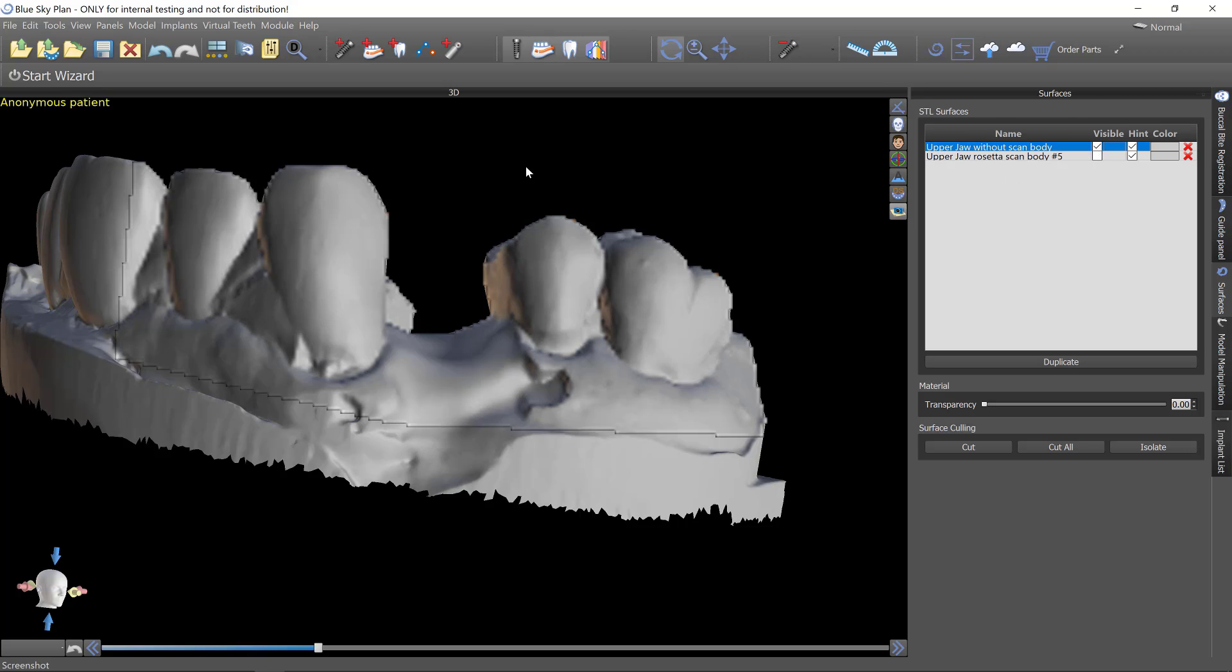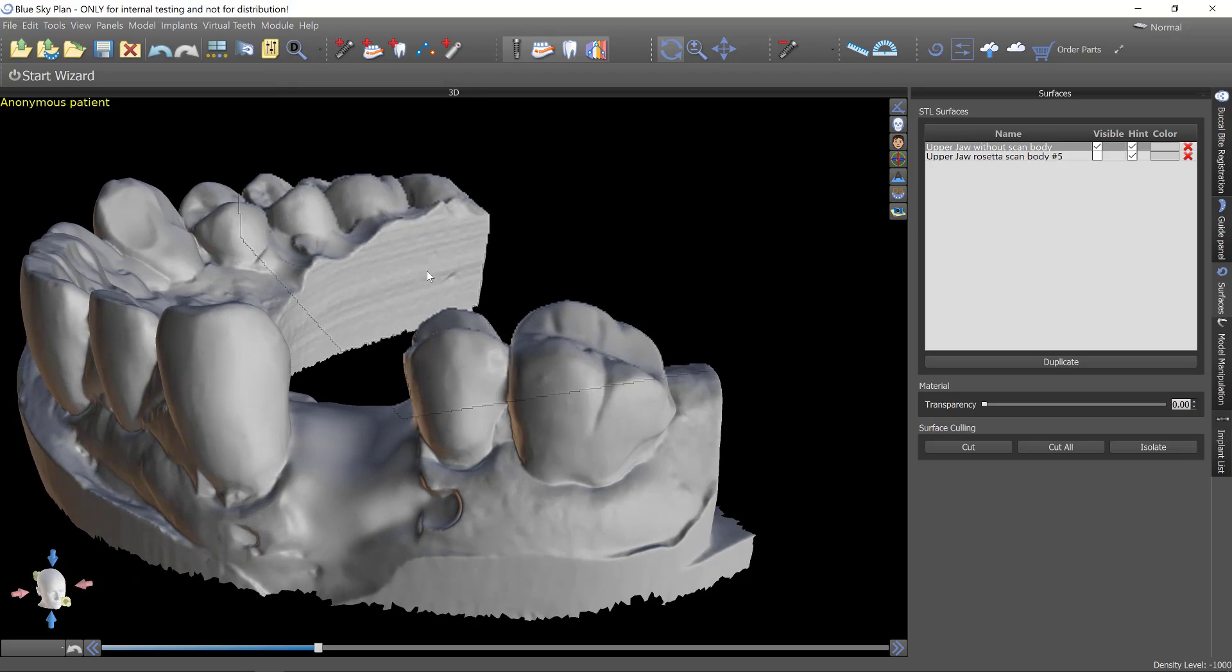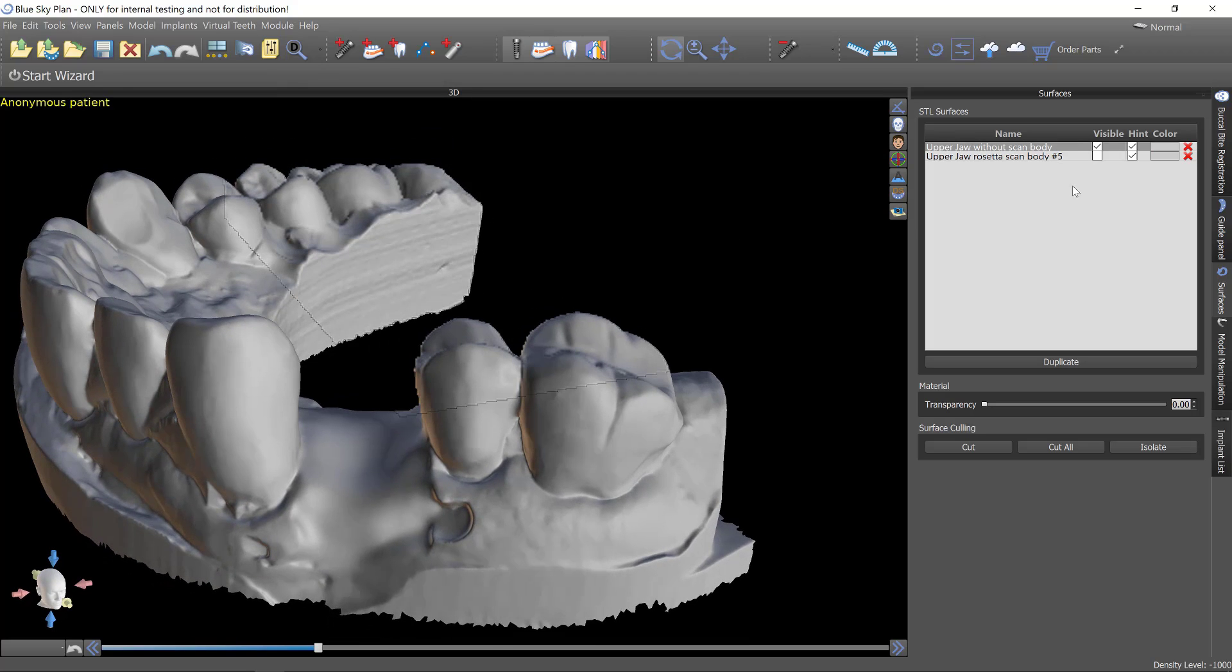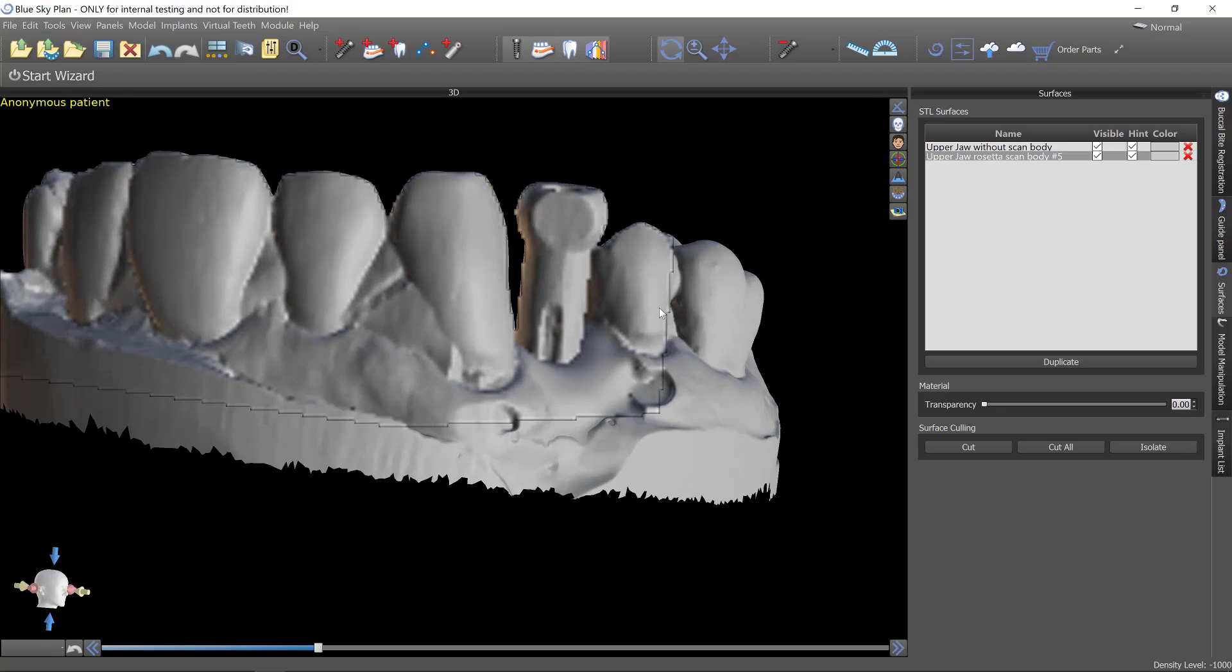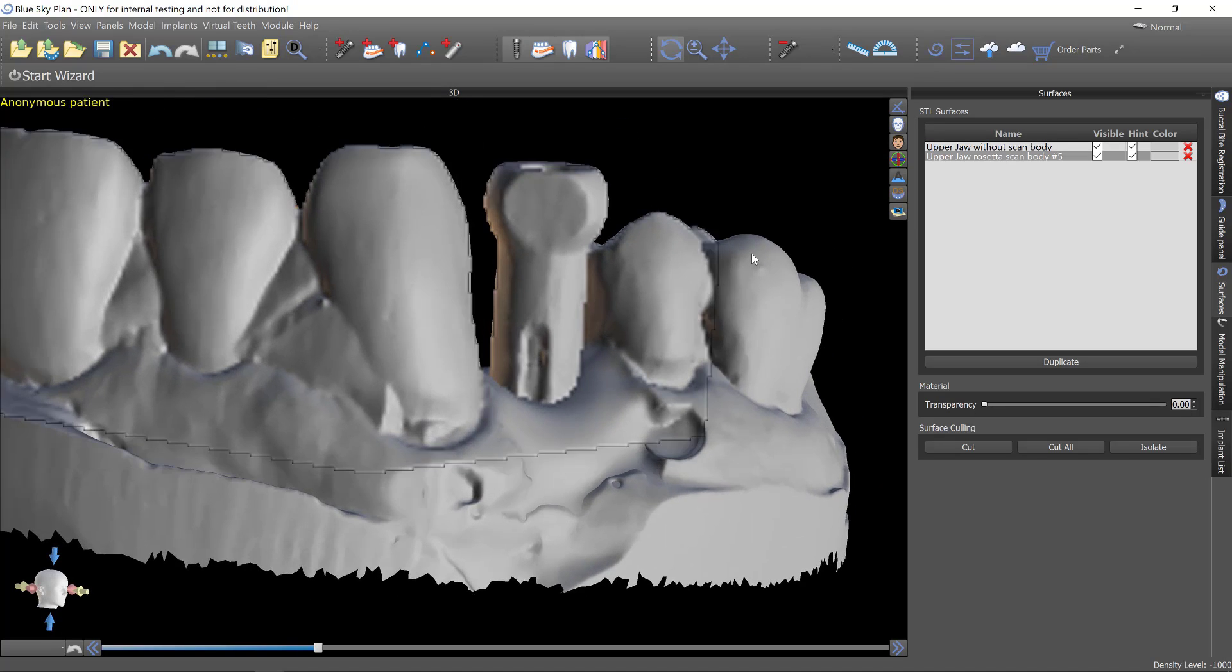And then there's a second model merged in here, which is just of the gingiva without any scan post. So let's first merge in a scan body and register the implant position.